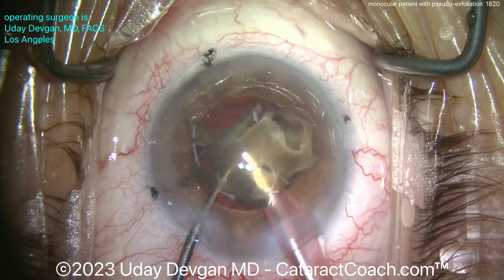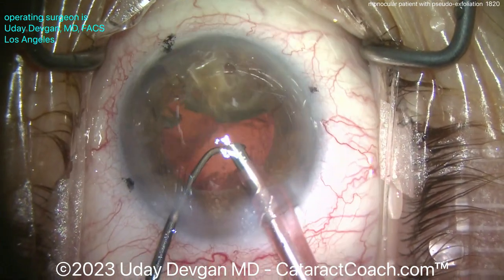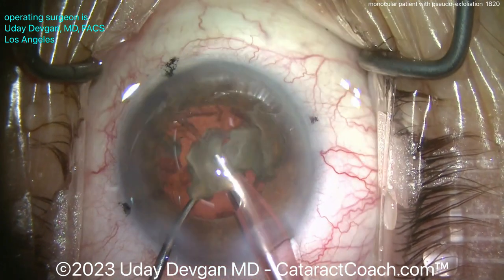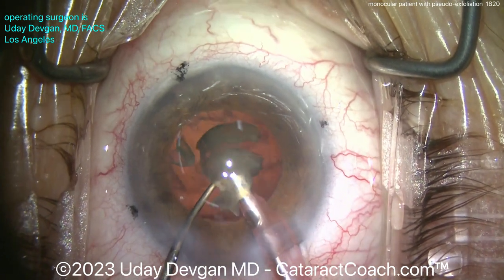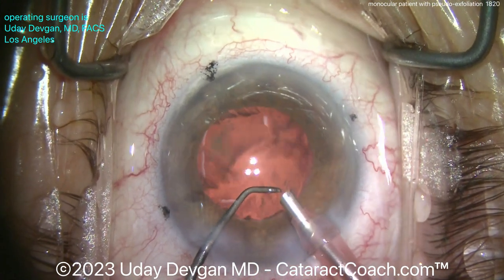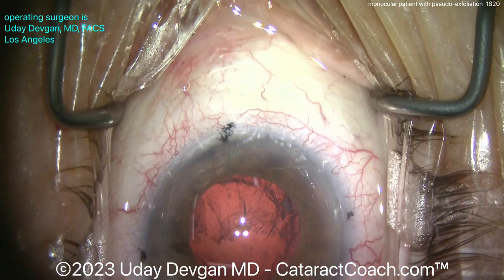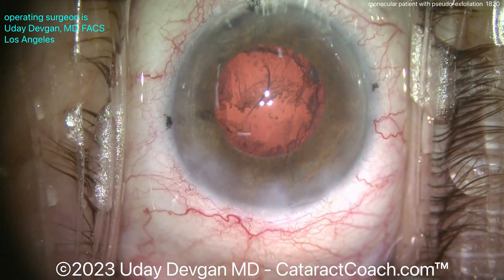I'm going extra slow here — showing the whole case today, start to finish, a longer case of about 10 to 11 minutes. You can learn a lot by watching these cases in real time; if you're bored you can always hit the 2x button on YouTube. Look at the last pieces coming down nice and easy, as slow as I can — I want stability. There you go, nicely done.